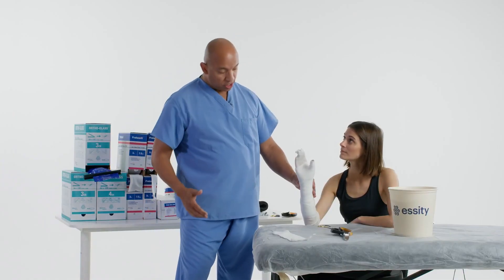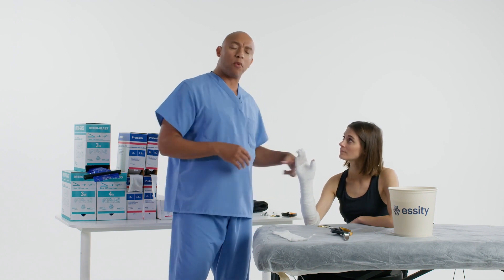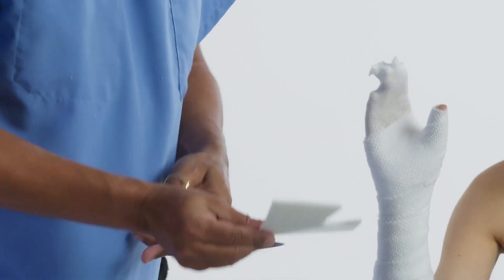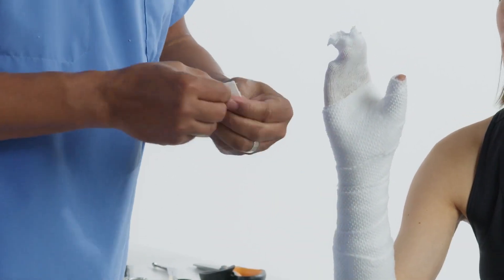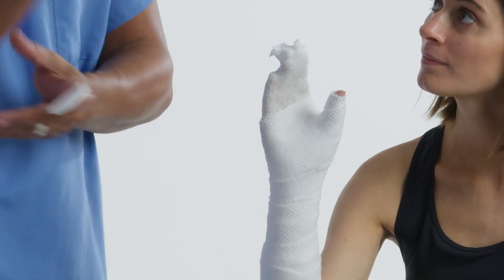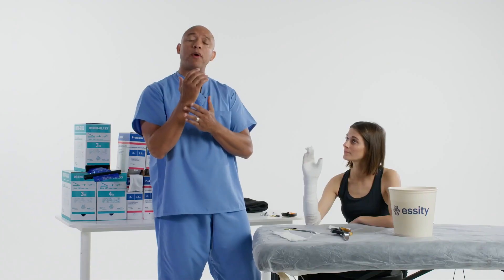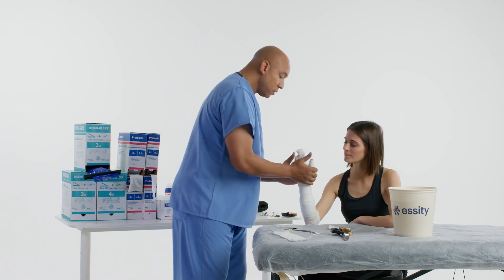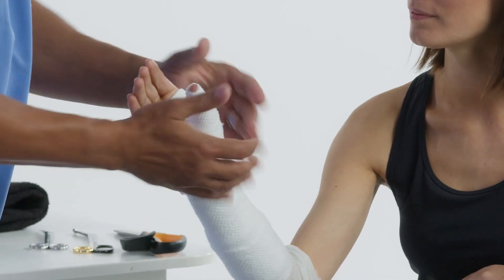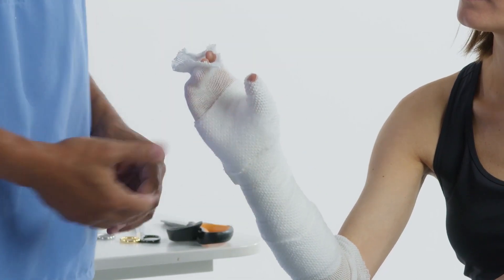Now we've applied the padding on the patient. If you palpate over the bony prominences and feel they're still a little prominent, you can apply more padding or apply some foam padding. Just take off the adhesive backing and put it on areas where the patient needs a little bit more padding — on this particular occasion, on the bony prominences of the ulnar styloid. You have a choice: you can pull the stockinette down now and put your splint on top, or wait until the splint is on and then pull your stockinette edges down.